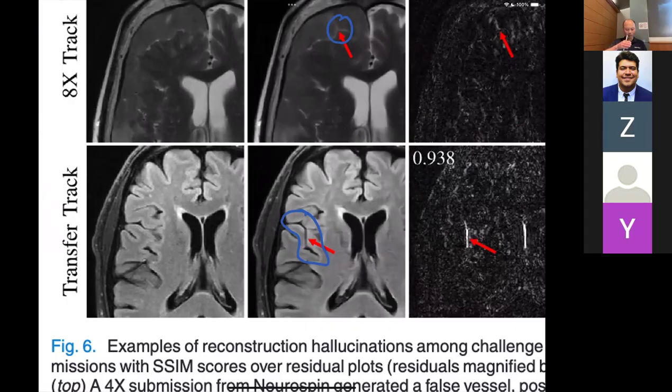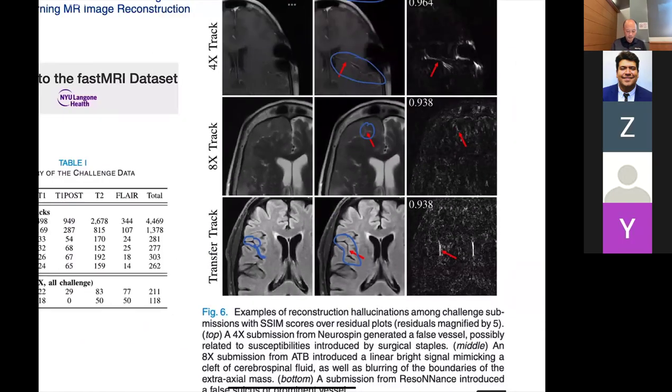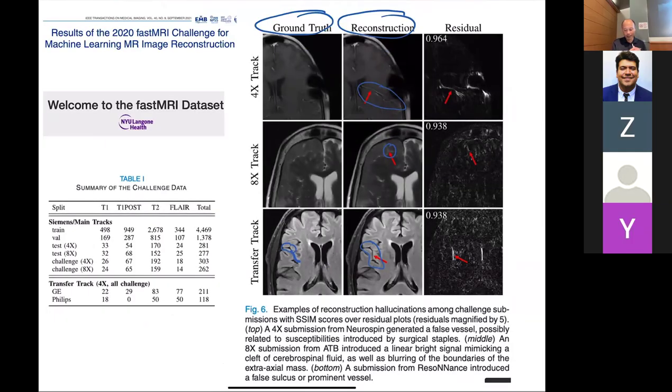That looks a little weird to me. But it matches this, and then it just adds on something like that, right? To the original image. So if you have enough experience, you could probably read through these artifacts, but that's the danger. So I think people are proceeding with caution because until people have enough experience with AI, they still have to be concerned with these artifacts.